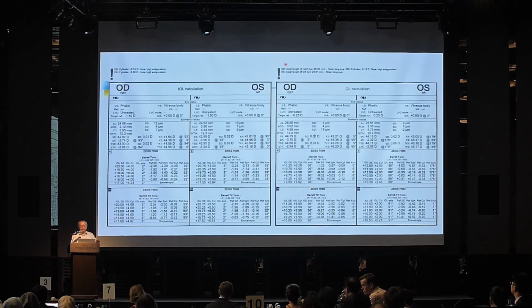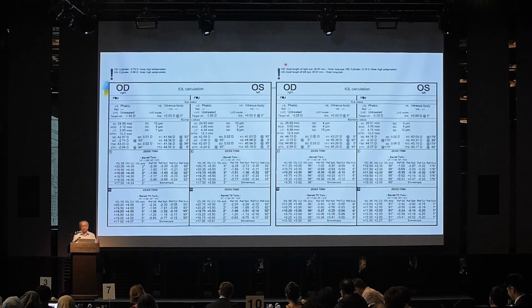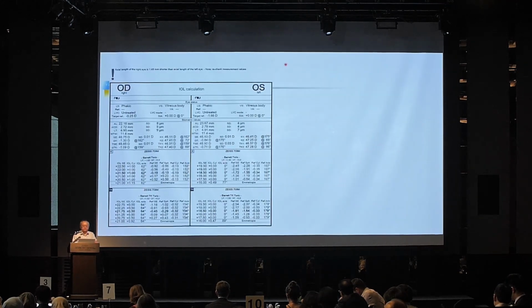I have 3 ways of looking at it. If you think it's unreliable, the biometrist has been informed, and you repeat the measurement. If it's still not reliable and you suspect something is not right, then get a second biometrist to repeat it. If not, then the patient comes back another day. It sounds tedious, but that's how we do it.